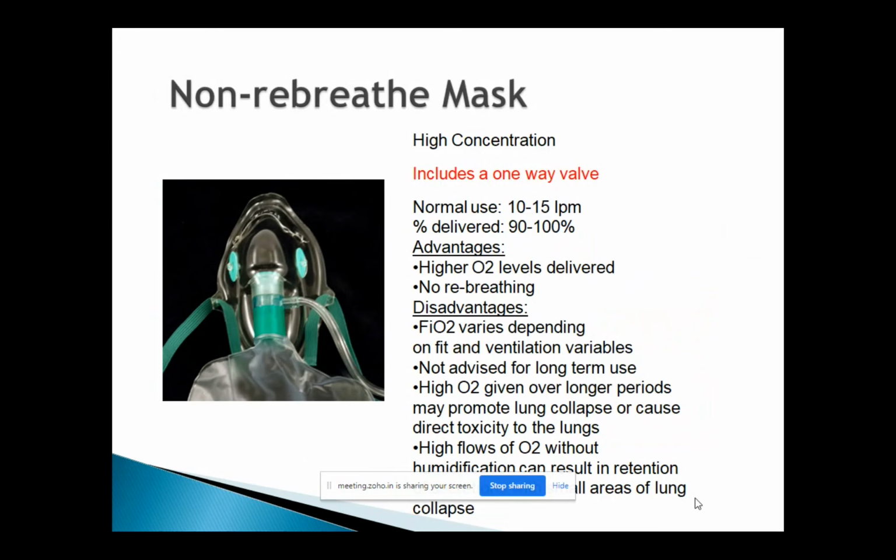The sooner you fill the mask, the sooner you fill the bag, the better for the patient, because the oxygen is readily available to flow towards the patient's face. So with less flow to this device, the bag won't be filled faster, or it will be inadequately filled. Patients will be breathing and the bag will be completely sucked empty, but the patient will continue to breathe. So you're not supplying the right amount of oxygen to the patient.